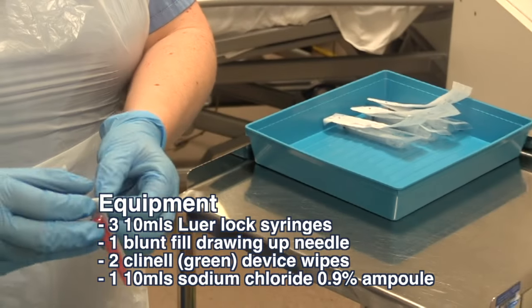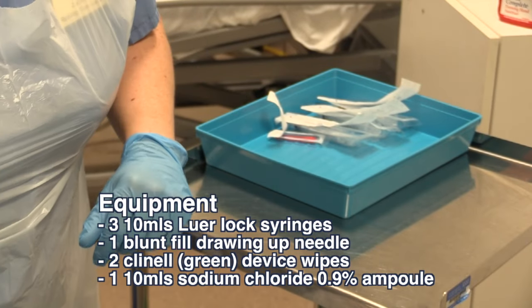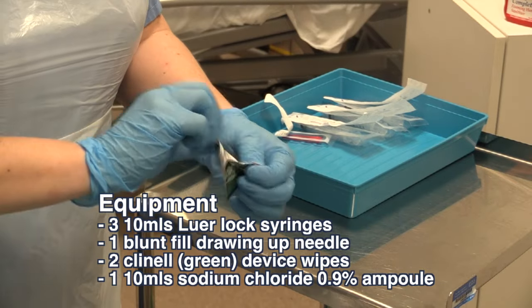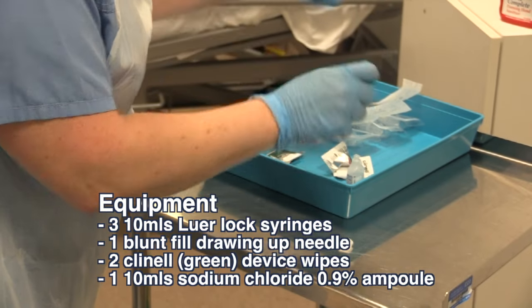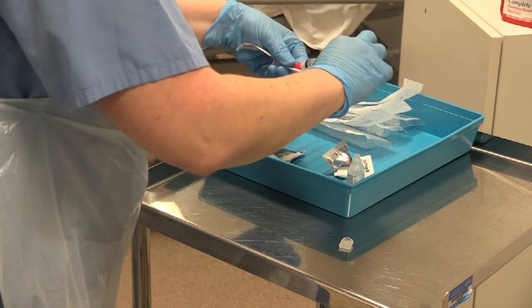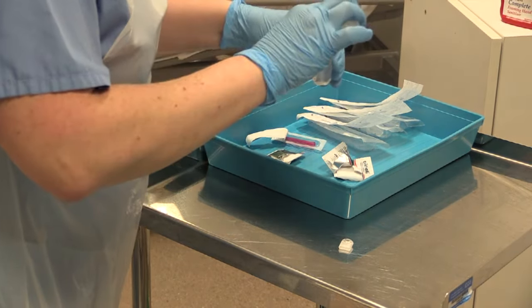You will need three 10ml Luer lock syringes, one blunt fill needle, two Clinell device wipes, and one 10ml ampoule of normal saline. Pre-fill one of the empty syringes with the normal saline using the blunt fill drawing-up needle. You will also need a clinical laminate sheet.